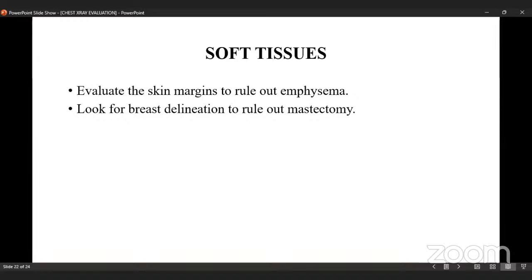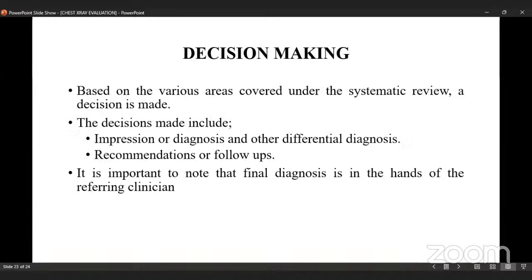Having gone through all the ABCDs and gotten to S, it is then that you come in to make your decision, or your diagnosis or differential diagnosis for further assessment or follow-ups. So before you can make your decision or diagnosis, you should be able to go through all the ABCD, the alphabet that you've made mention of earlier. That's when you can make your impression, your differential diagnosis for further medical assessment or checkups, give your recommendations based on what you've seen, and then also give follow-ups.